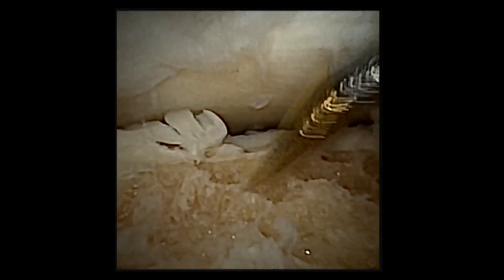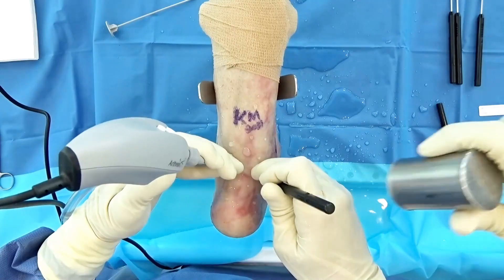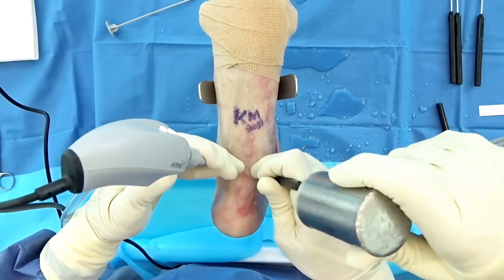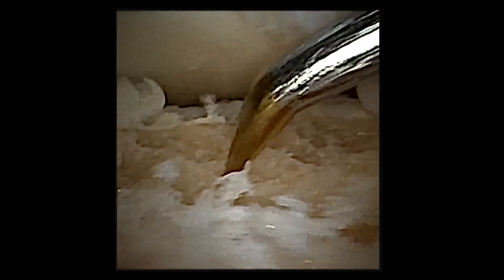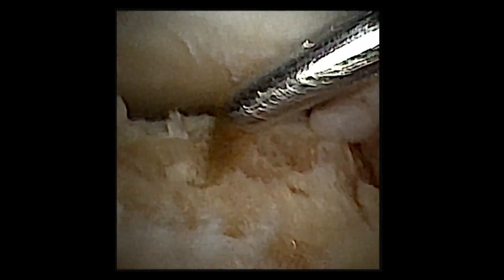One more thing: if you have little areas you can't reach, this is their microfracture pick — it is tiny. Imagine this is on a microscope inside the subtalar joint. We can give it a couple of taps. If you get hard-to-reach areas — say you're doing an ankle fusion and need to go up into the medial or lateral gutters — this gives you a really nice access point. It's easily bendable so you can get to all these different areas, really making the equipment work for you. You can make those spots soft and get everything ready for fusion.